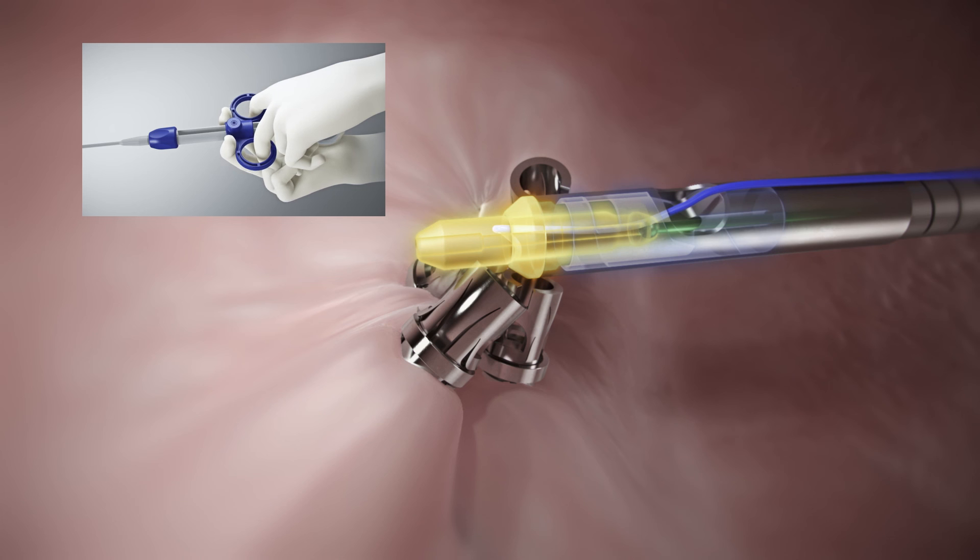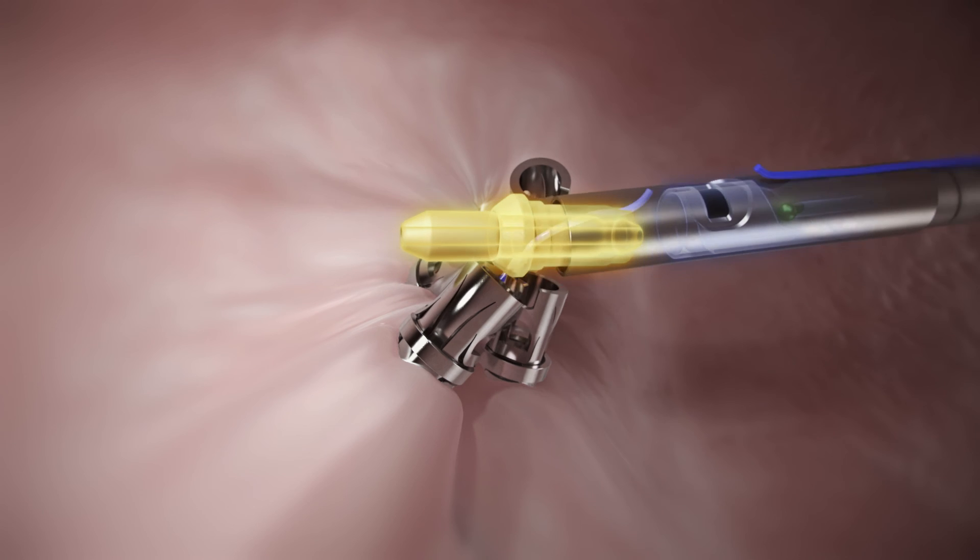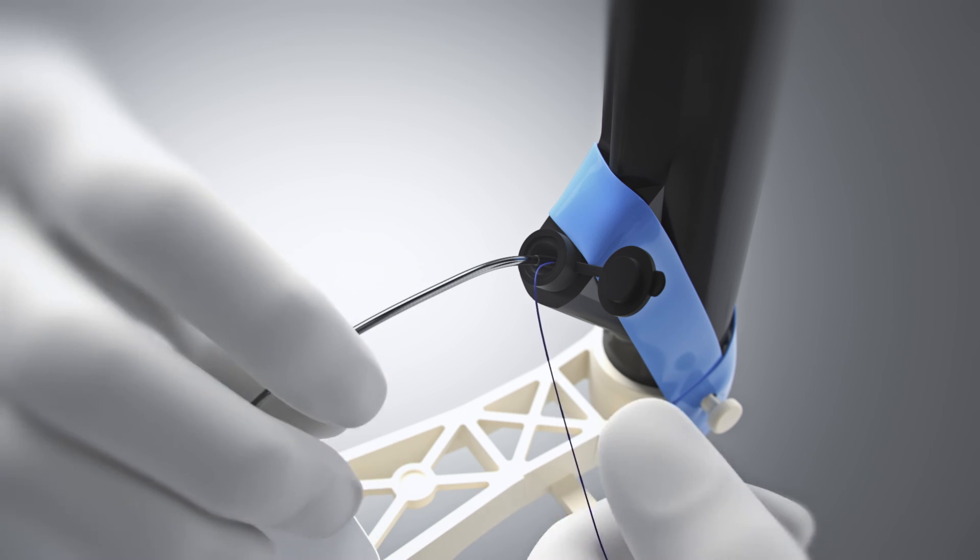Finally, continue to squeeze the handle to activate the suture cutter and release the peak collar and plug. Remove the cinch and remaining suture from the scope channel.